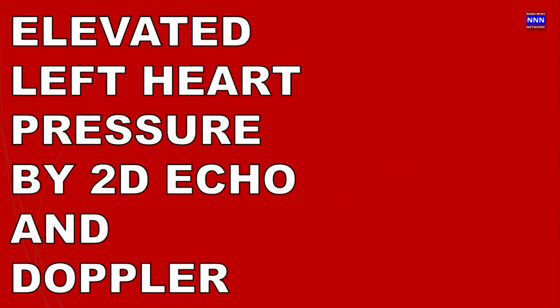So you have been listening to the presentation on elevated left heart pressure by 2D echo and Doppler studies.